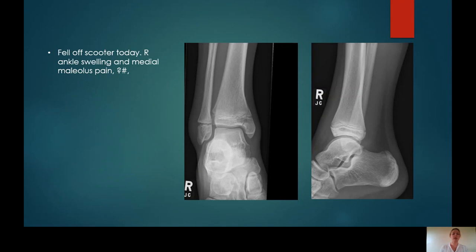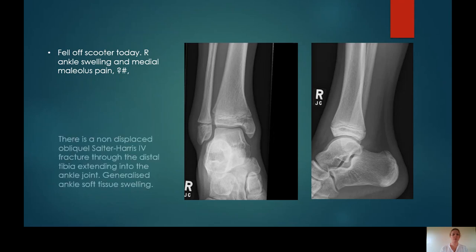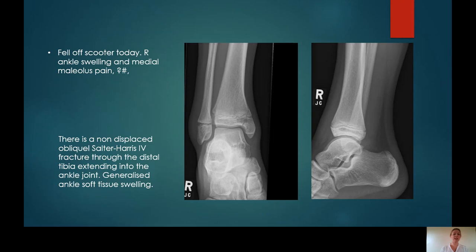Case 6: Fall off scooter, right ankle swelling and medial malleolus pain, query fracture. This is an undisplaced Salter-Harris type 4 fracture. On the AP, we can see an oblique lucent line running adjacent to the medial malleolus, going up and involving the physis, and then another oblique fracture line extending into the metaphysis. So this fracture has gone through the metaphysis, physis and epiphysis — a Salter-Harris type 4 fracture.